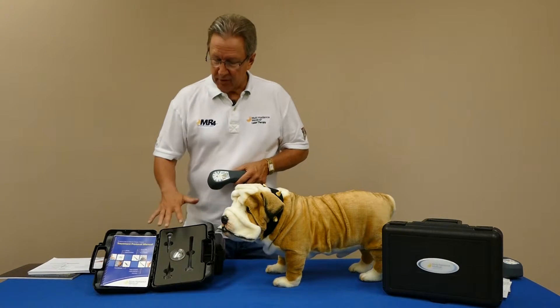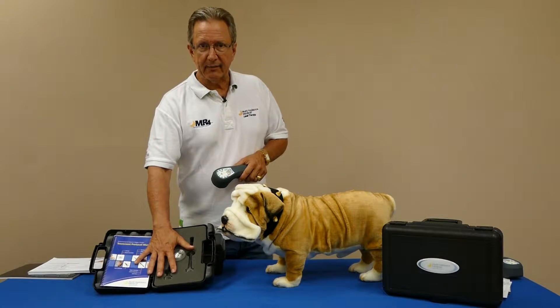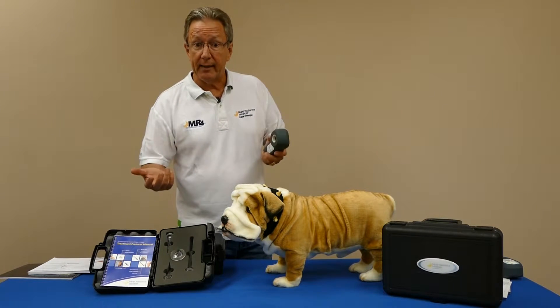Now let's talk about your probes. You have a set of four probes that come with the Activate system, so let's talk about which one to use, and why and when.